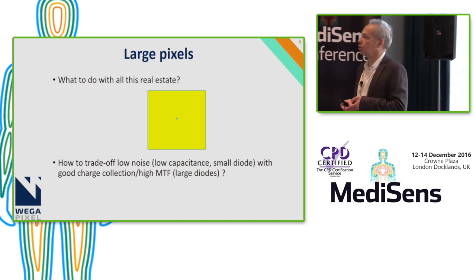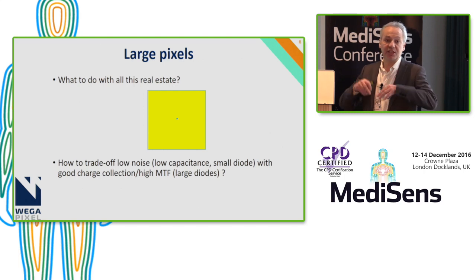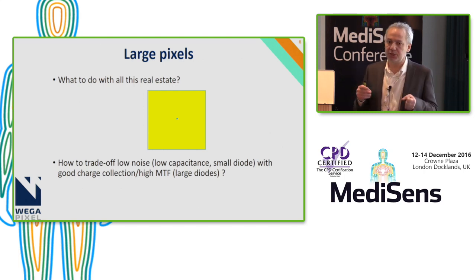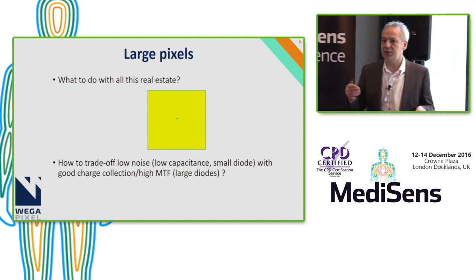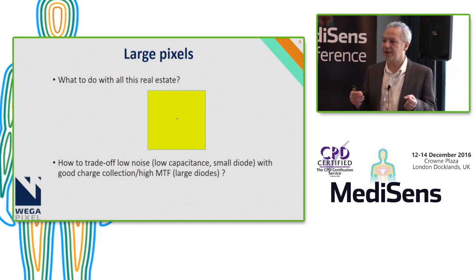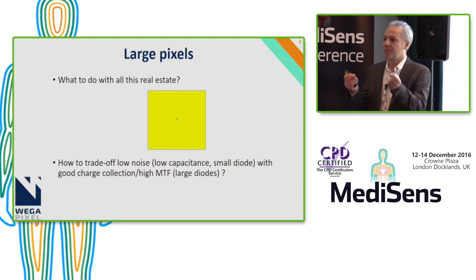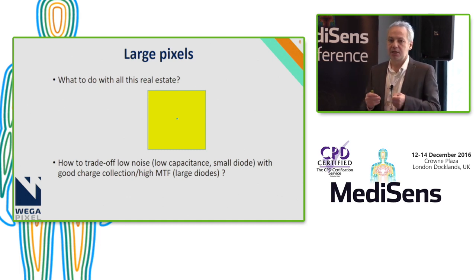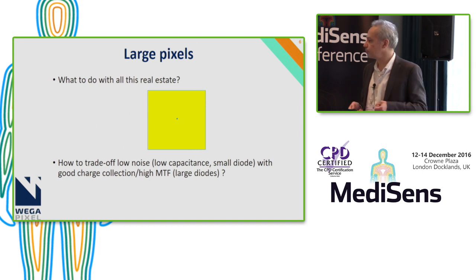The other consideration is that making large pixels is not just putting things in the pixel. There are also other considerations. One has different trade-offs for noise and charge collection in the pixel, so it requires careful design, which is a bit different from a small pixel, where the light is collected immediately. With one micron, you diffuse or drift there, and it's collected. In a large pixel, if you do a very small diode, the charge has to travel a long way in the silicon, so there could be other effects related to this.